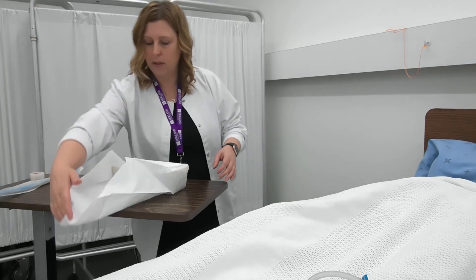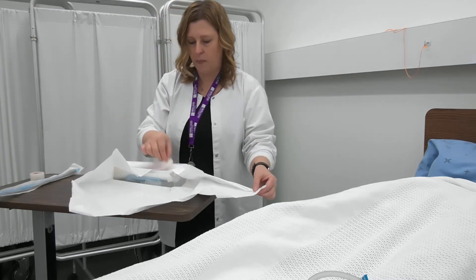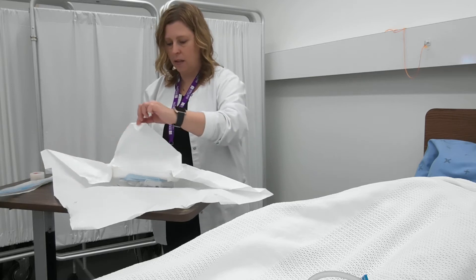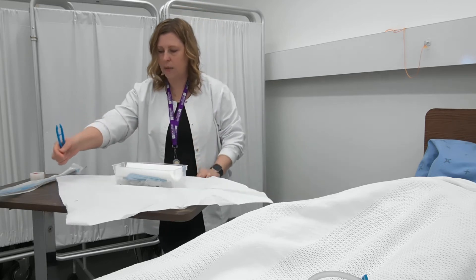This first fold will go down this way, then the sides, keeping in mind that I have that one-inch contaminated border.